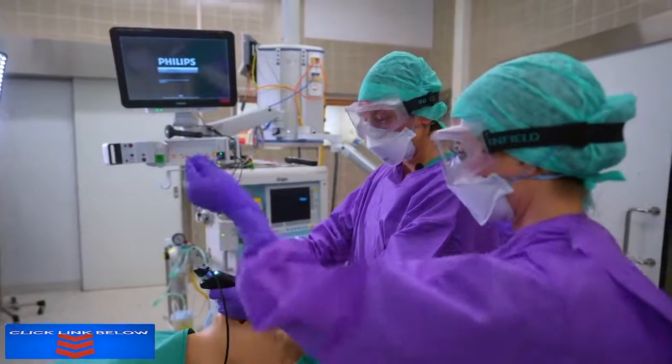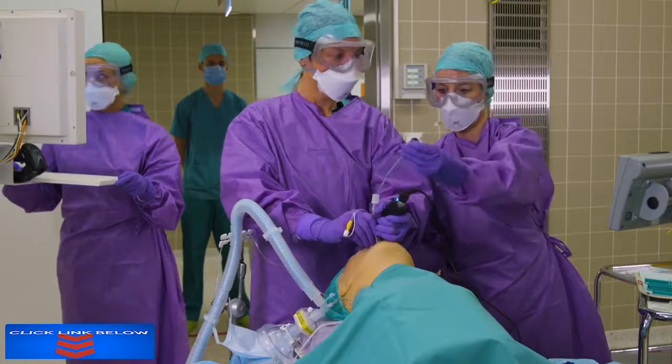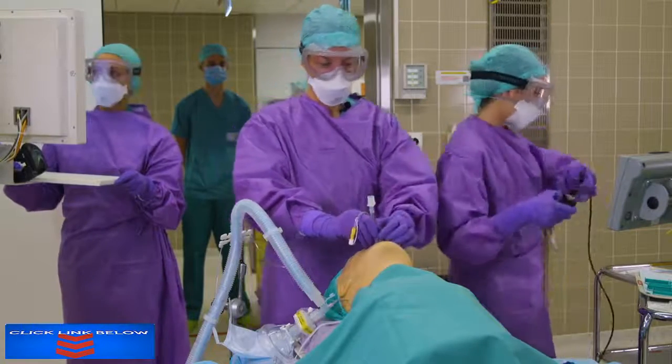The endotracheal tube now is in place. The stylet can go. Thank you. It's important to inflate the cuff before ventilating the patient.